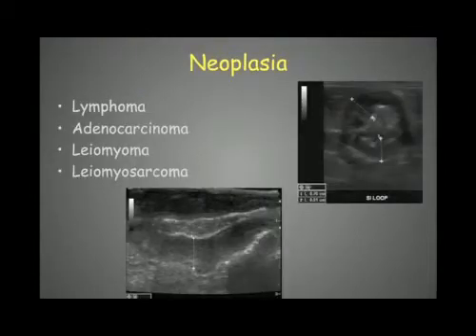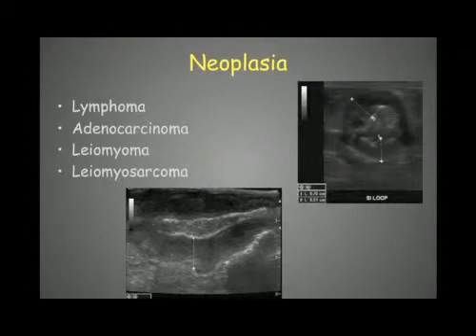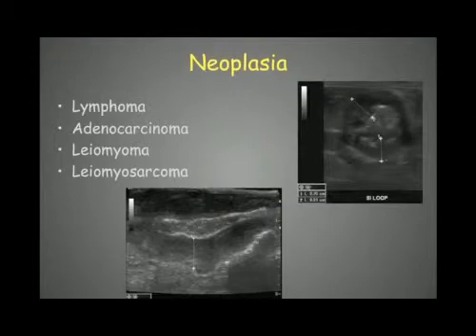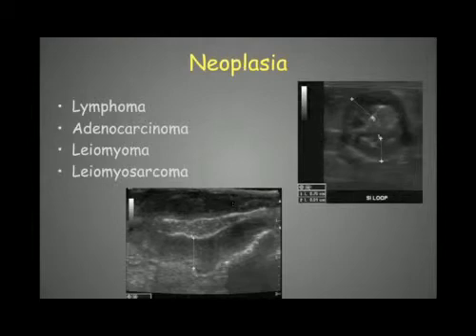Neoplasia of the GI tract can be visible with ultrasound. The most common types are lymphoma, adenocarcinoma, leiomyoma, or leiomyosarcoma. It is often difficult to determine the exact histologic type by ultrasound alone — cytology or histology is needed for a definitive diagnosis. These neoplasias have a typical ultrasonographic appearance with wall thickening — here 8 to 9 mm in this cat — and are hypoechoic with loss of layering.